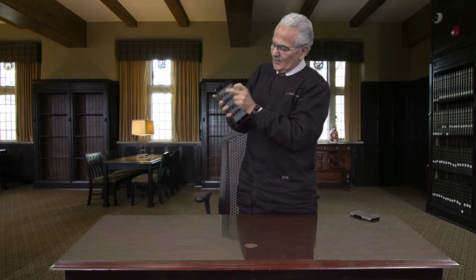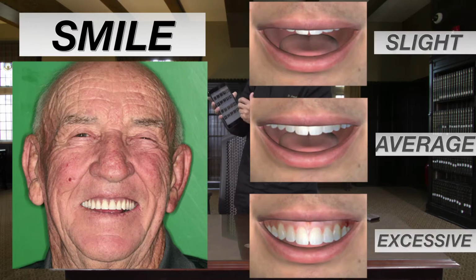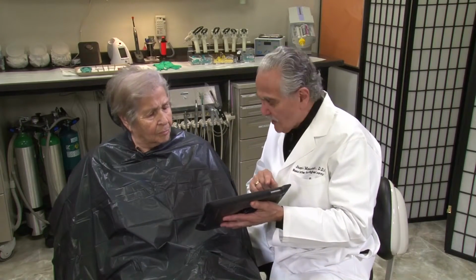And as they go into the app, if you look real closely, you can punch on the patient and their picture becomes large. They could then look at this, and then take a look at the different choices. Mrs. Smith, it looks like you have no show of teeth when you're slightly open. And when you smile, you may have no show of teeth, or you may have excess show of teeth and tissue. So at this point, the patient and I are discussing all of this together, and it makes so much sense.